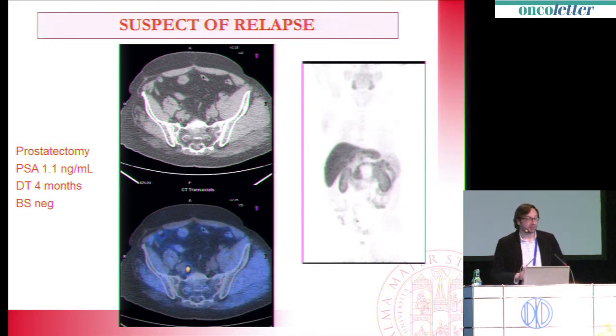It has been emphasized by the surgeon and the radiation oncologist. After intervention, about 30 to 40% of patients will experience a recurrence. That's to say the PSA will rise, and the patient will get crazy about that because there's no clue about where it occurred. And that's probably the setting in which PET-CT can really make the difference.